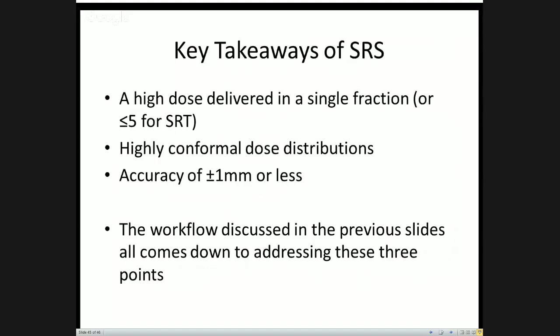For the 3% 3 millimeter criterion for IMRT QA, yes, we still do use those for SRS plans, and it's maybe fair to question whether that's as appropriate given the accuracy that we're seeking to achieve. But I think it's important to keep in mind that those tolerances are not just based on what's acceptable for the plan, but also the setup that you're using.